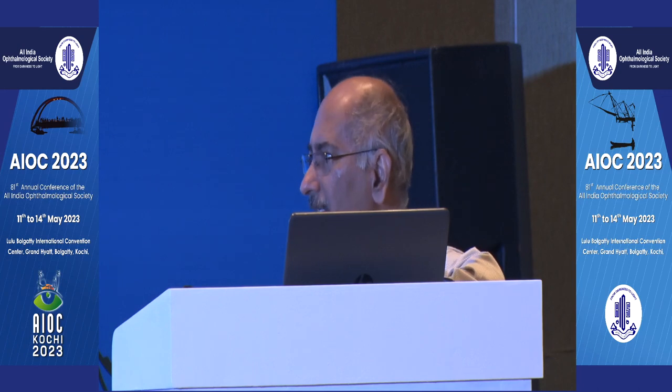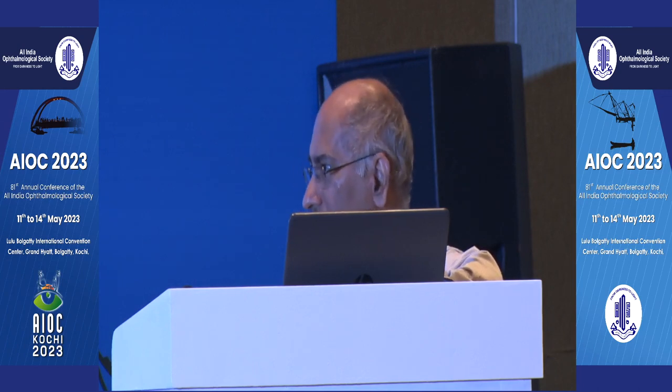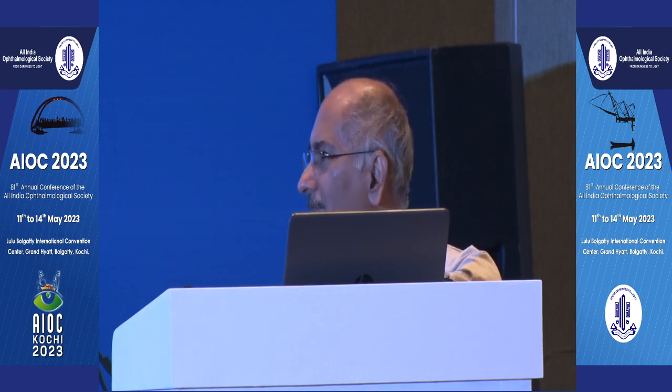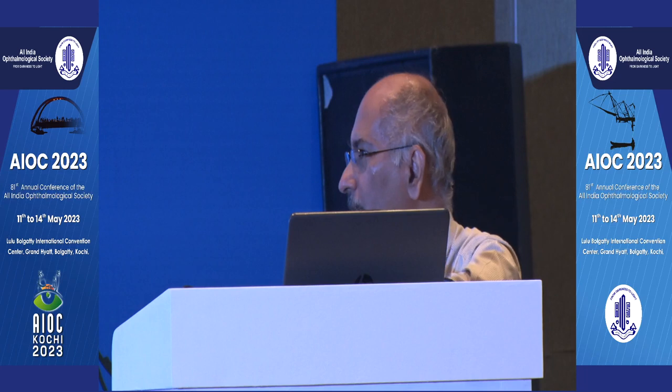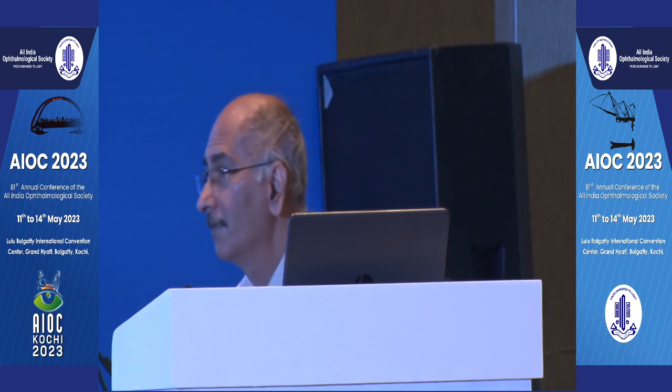The macula has been preserved. Central vision, which is what we use most of the time, has reasonably been achieved. And it's going to be a work in progress. But I think we've been able to achieve a reasonably good result. Currently, if it's maintaining, it's best to just watch it.